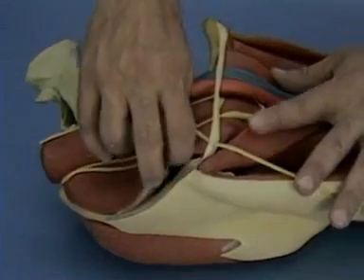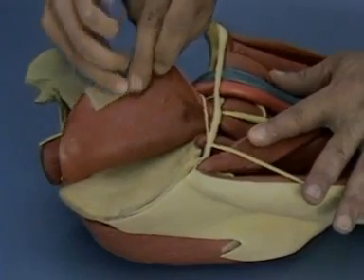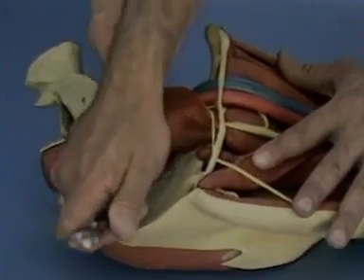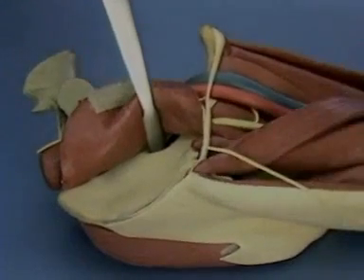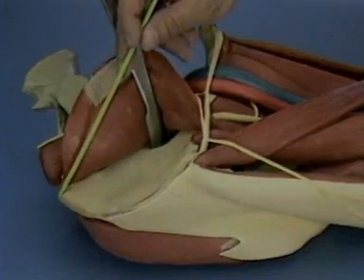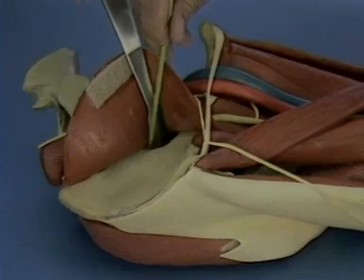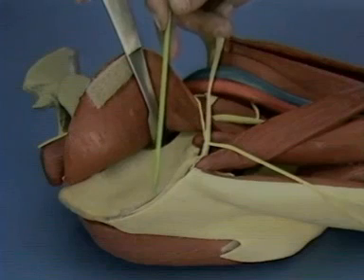The first window of the ilioinguinal is opened by reflecting the iliacopsoas muscle and the abdominals in a medial direction. A Hohmann retractor is placed with its tip over the pelvic brim. The entire internal iliac fossa is now exposed, along with the anterior sacroiliac joint, the upper portion of the pelvic brim, and the upper portion of the anterior column.